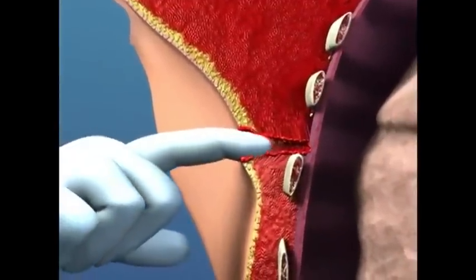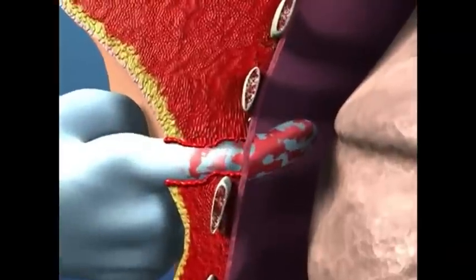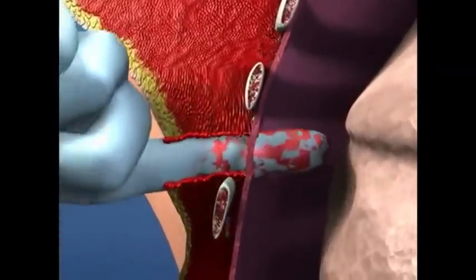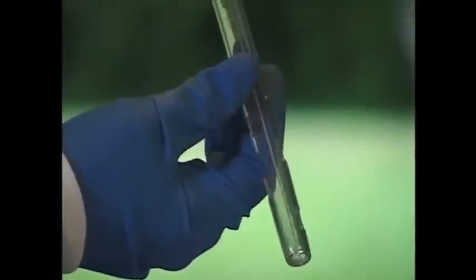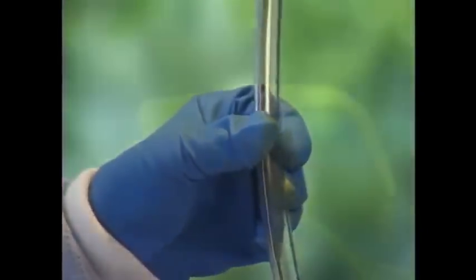place your finger into the hole of the pleura. Move your finger around 360 degrees to confirm correct location in the pleural space by feeling the lung and making sure that there are no adhesions or impediments to placing the chest tube. A large chest tube, a number 36 or number 40 French, is used in trauma to allow for the evacuation of blood and clots.